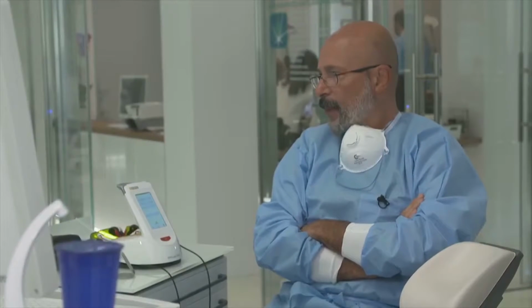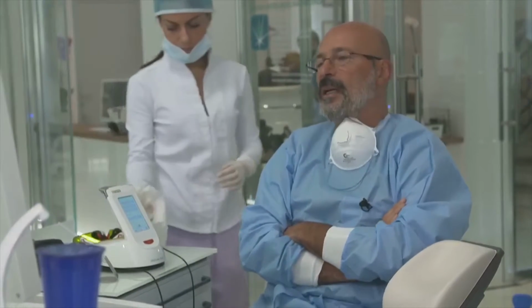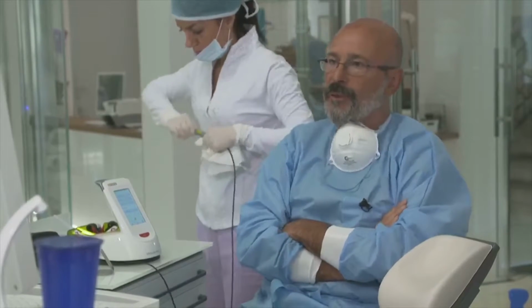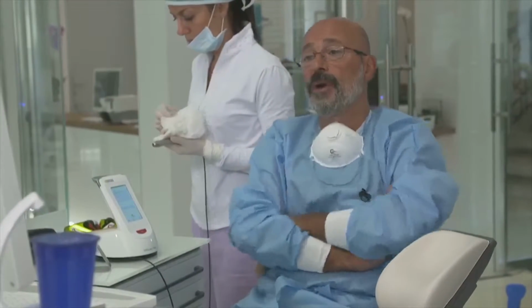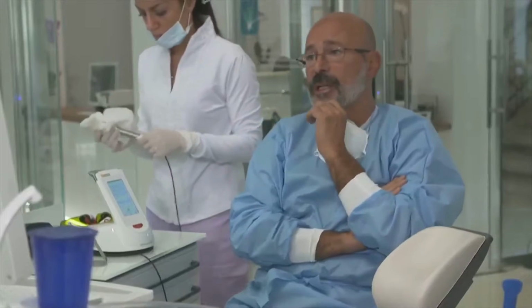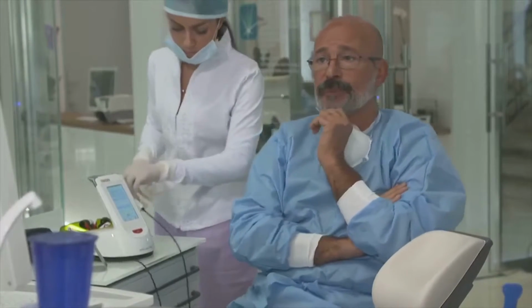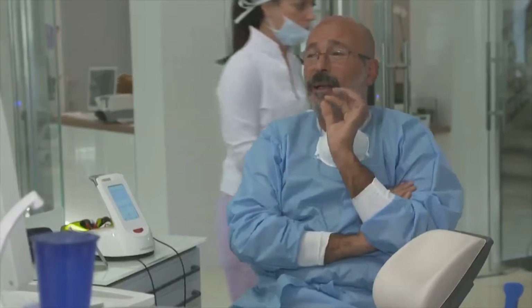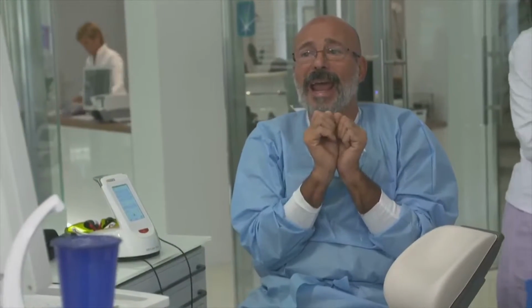Yes. If you use the right rate and the right wavelength, you can expect a similar healing process. And there is a little bit of difference in some phases of the healing process. You know that diode laser tends to produce more pronounced changes than conventional scalpel surgical procedure due to a little bit of thermal tissue damage, with corresponding greater inflammation and delay in tissue organization only at the initial stage.